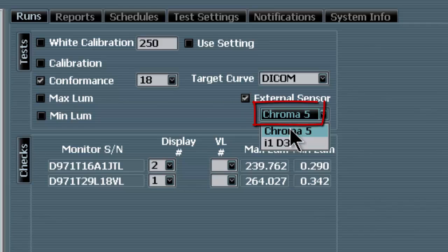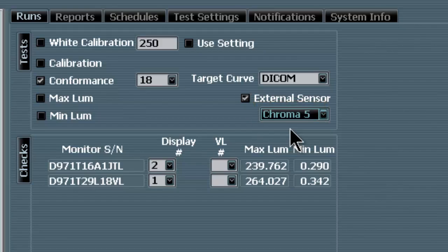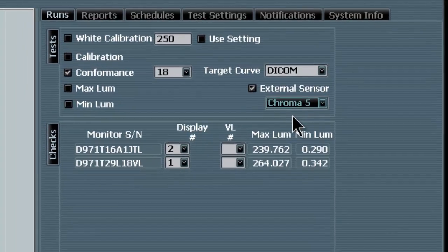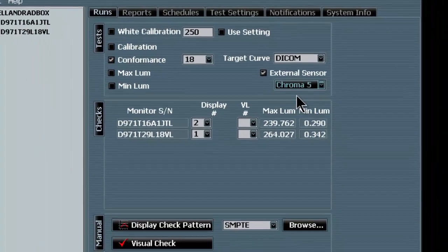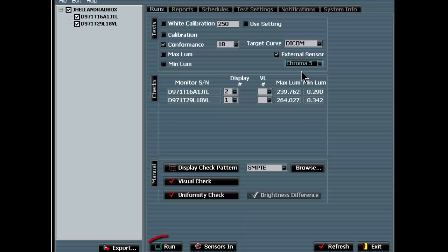In the drop-down menu, we must choose the appropriate selection for the puck we are using. For Verilume pucks, choose the Chroma 5 option. And for the X-Rite puck, choose the I1-D3 option. Finally, at the bottom of the XCal menu, we will click Run to launch the test.